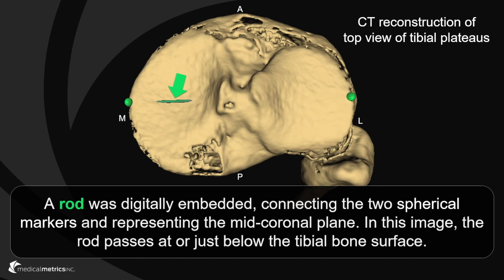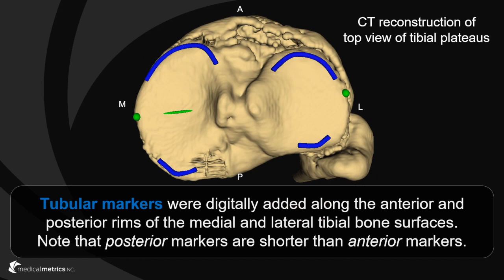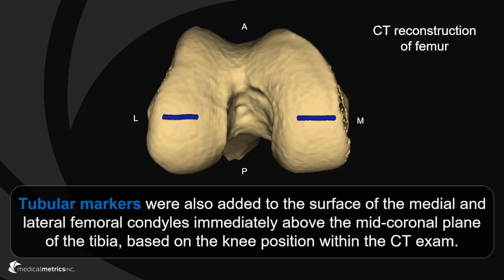In this knee, the rod passes at or just below the tibial bone surface. Tubular markers were added along the anterior and posterior rims of the medial and lateral tibial bone surfaces. Note that the posterior markers are shorter than the anterior markers. Tubular markers were also added to the surfaces of the medial and lateral femoral condyles immediately above the mid-coronal plane of the tibia, based on the knee position when the computed tomography exam was obtained.